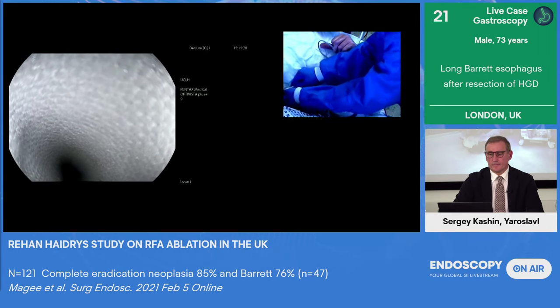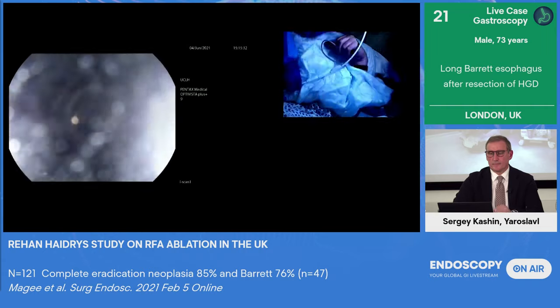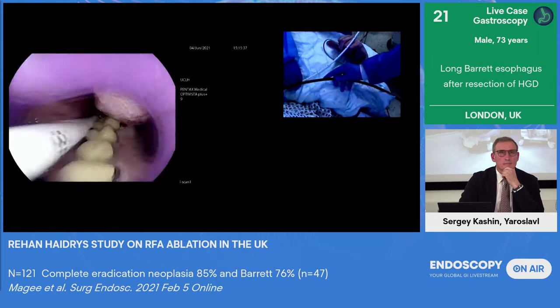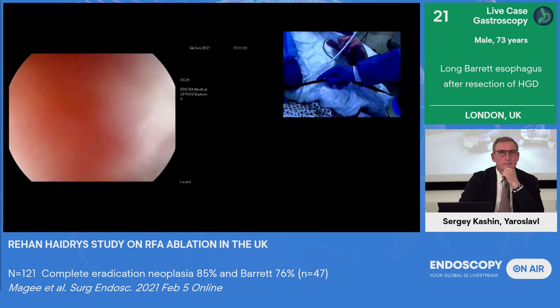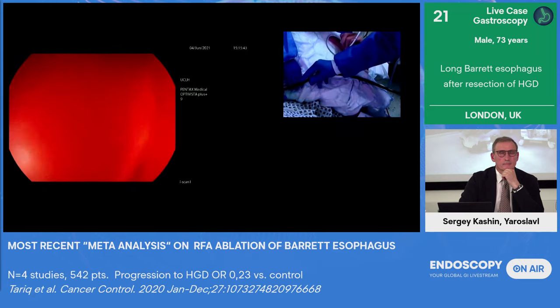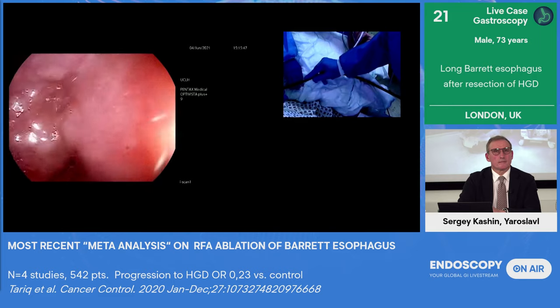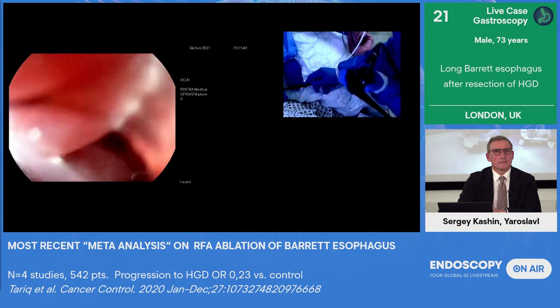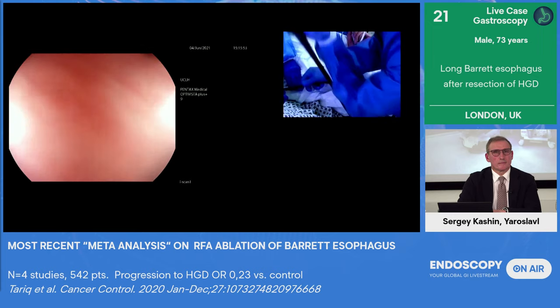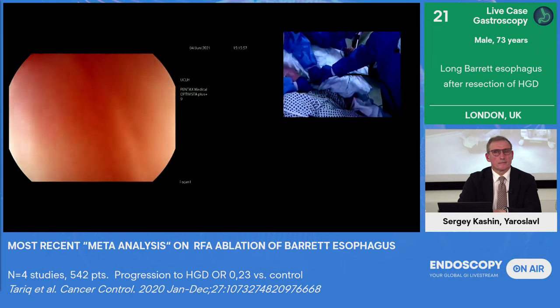Can be very tricky with these catheters sometimes, especially when you've got a bit of cricopharyngeal spasm. So Vinay's just making sure that he's very measured in his approach, and all he's done is go back with the catheter and use a bit of stiffening on the wire just to help delivery of the catheter into the esophagus. And now he'll show you a quick ablation before you go on to the next center.